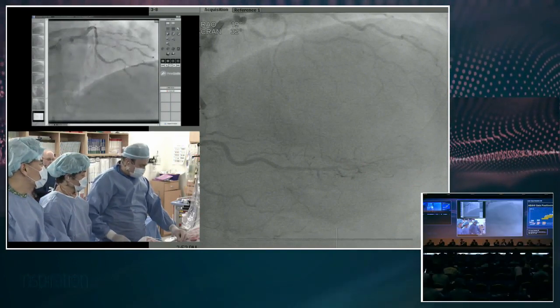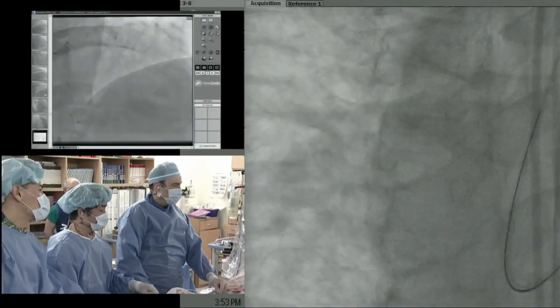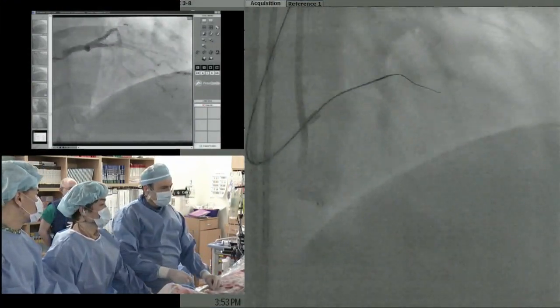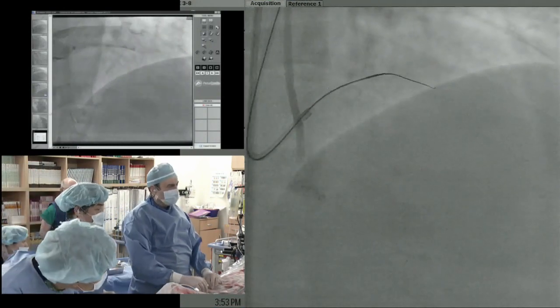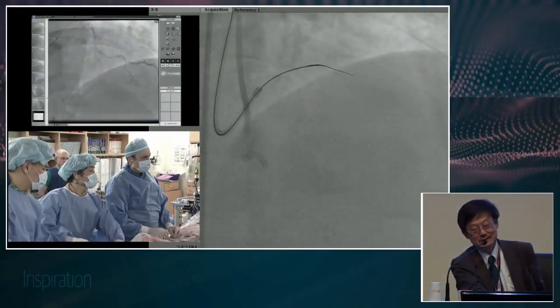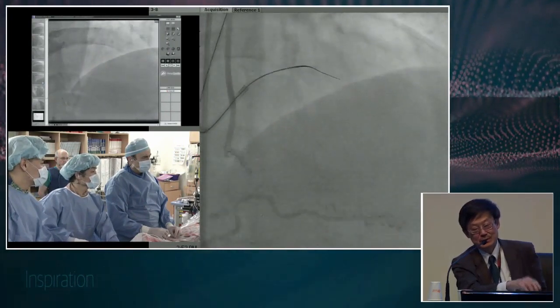Of course, if they have a possible microchannel, I like to be stepwise. But maybe Dimitri, you like to just jump directly using the same taper wire, but with somewhat stronger penetration force.